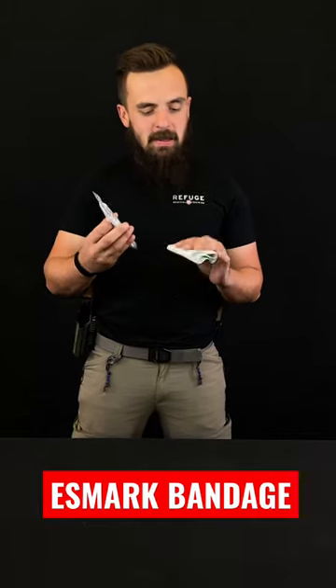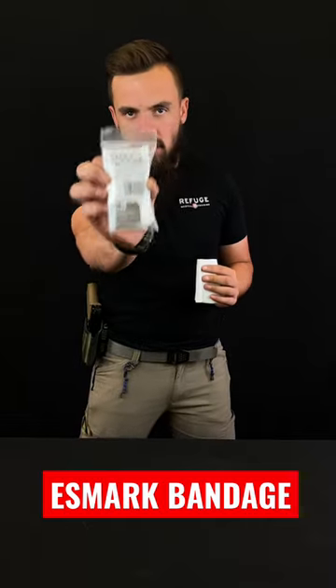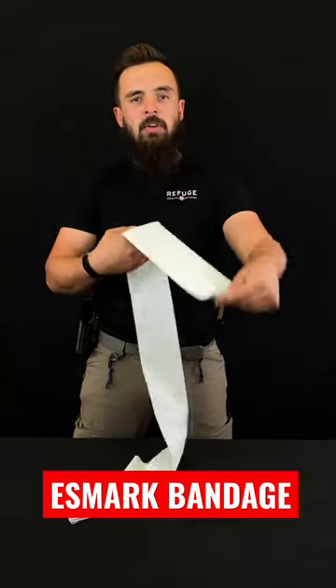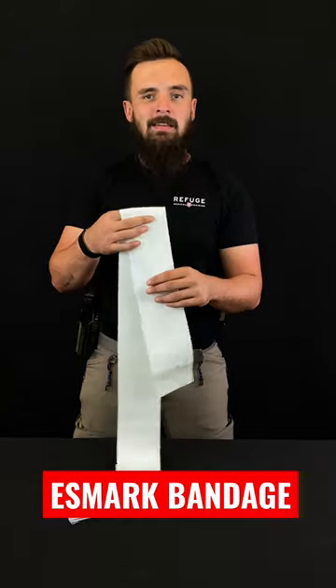Hey guys, Bob with Refuge Medical and today we are talking about child tourniquets. More specifically, we're talking about the Esmark bandage from TacMed Solutions. Now, this is my most recommended child tourniquet solution and the reason being is this will fit on any size limb.